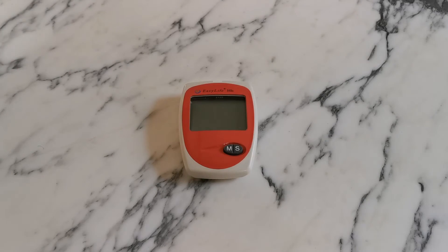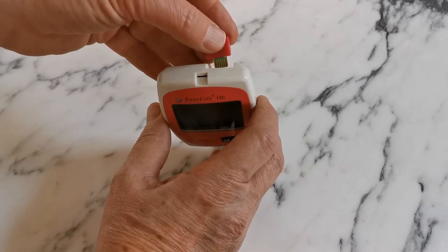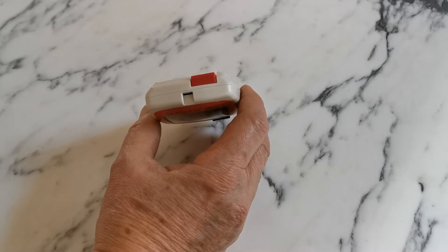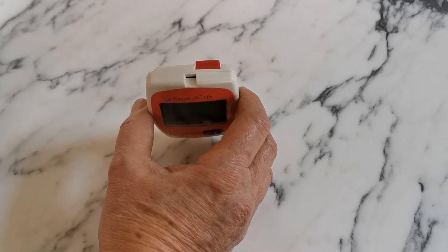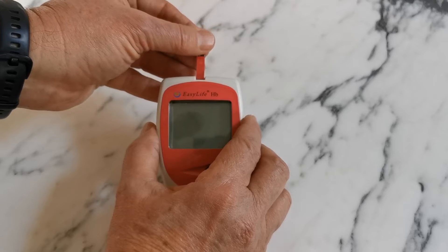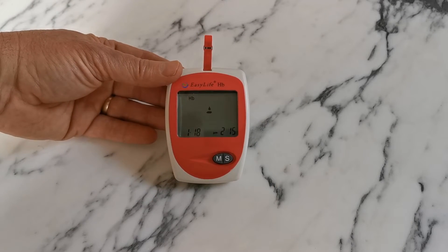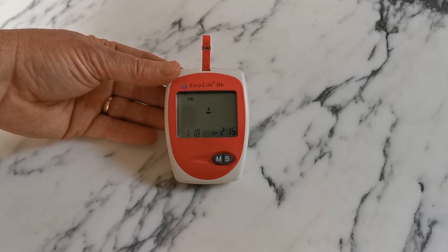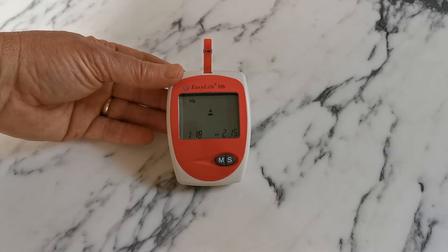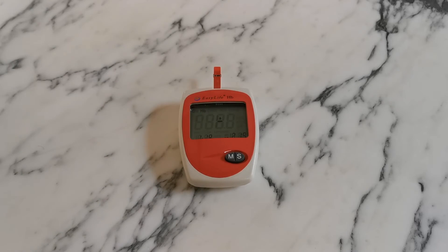When you intend to do your first haemoglobin test, insert the code chip supplied with the test strips into the top of the meter. Then take a clean, unused test strip and insert it into the strip port on the front top of the meter. The code will be displayed, followed shortly by a flashing blood droplet, indicating that the meter is waiting for you to perform the test.